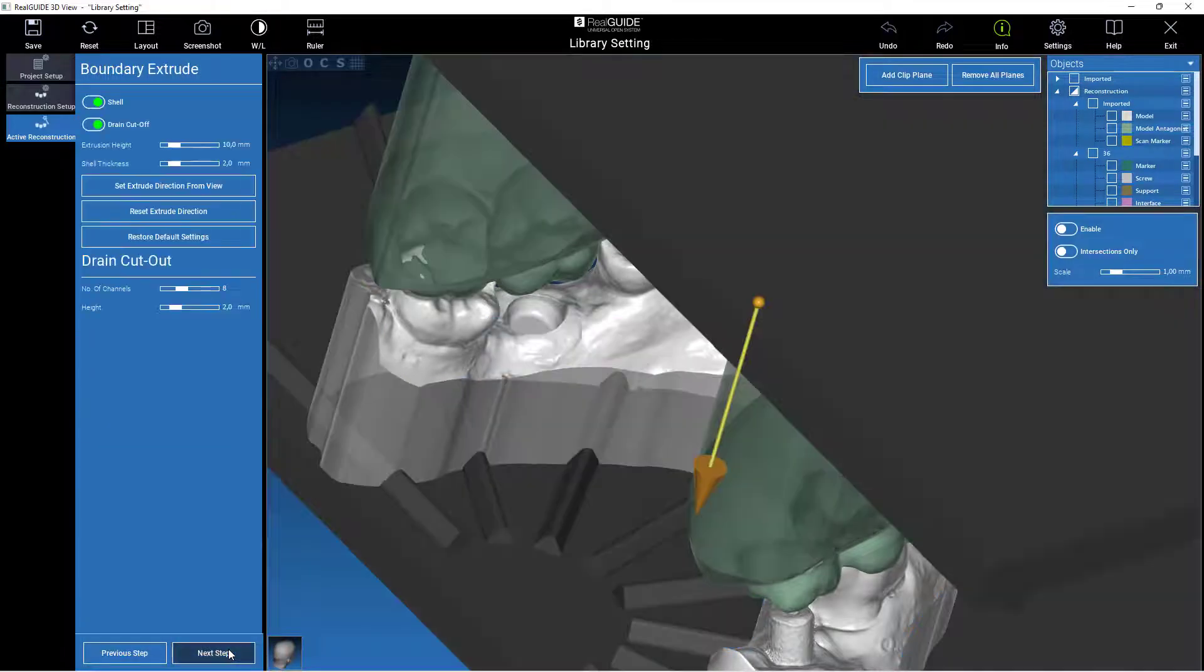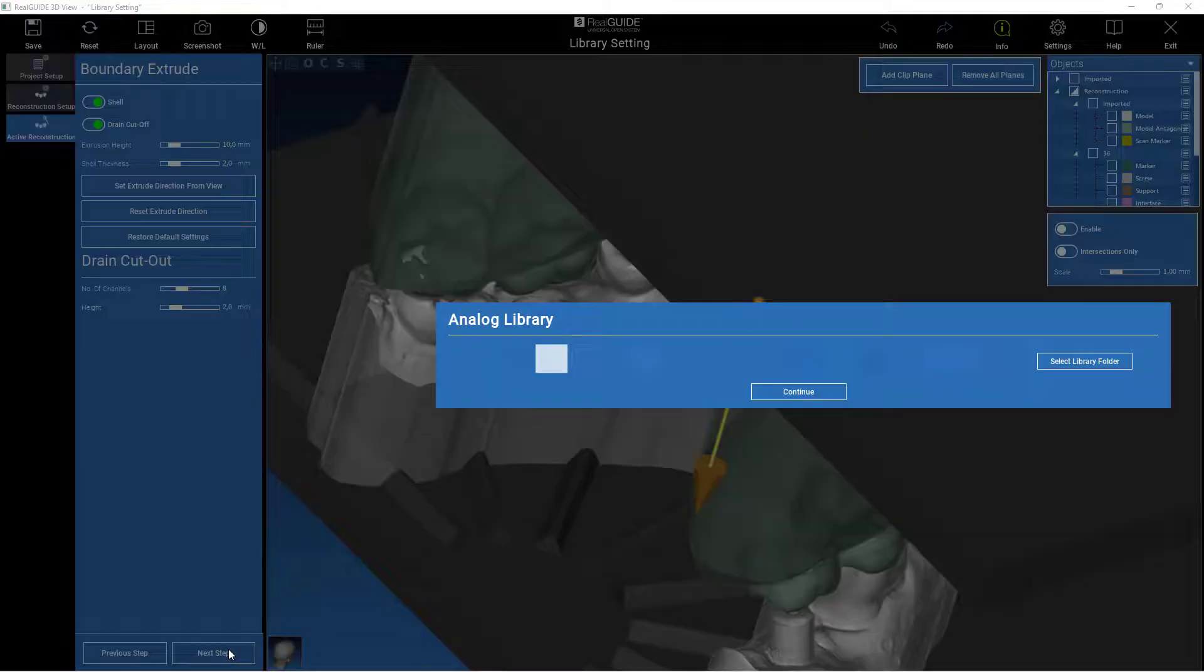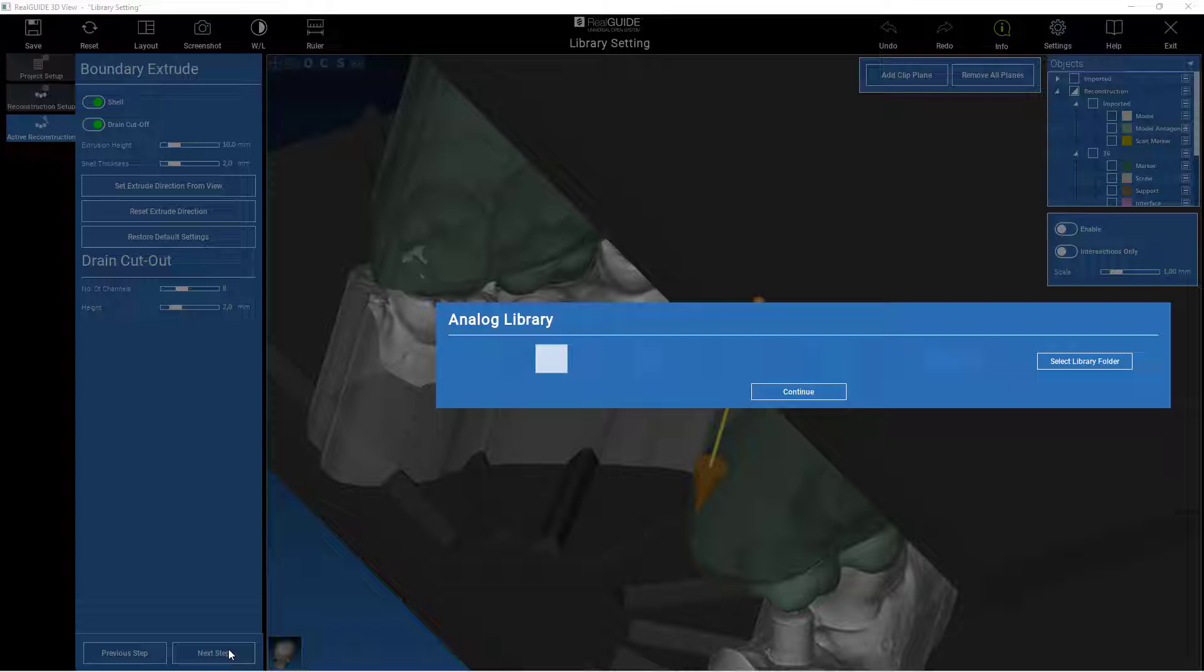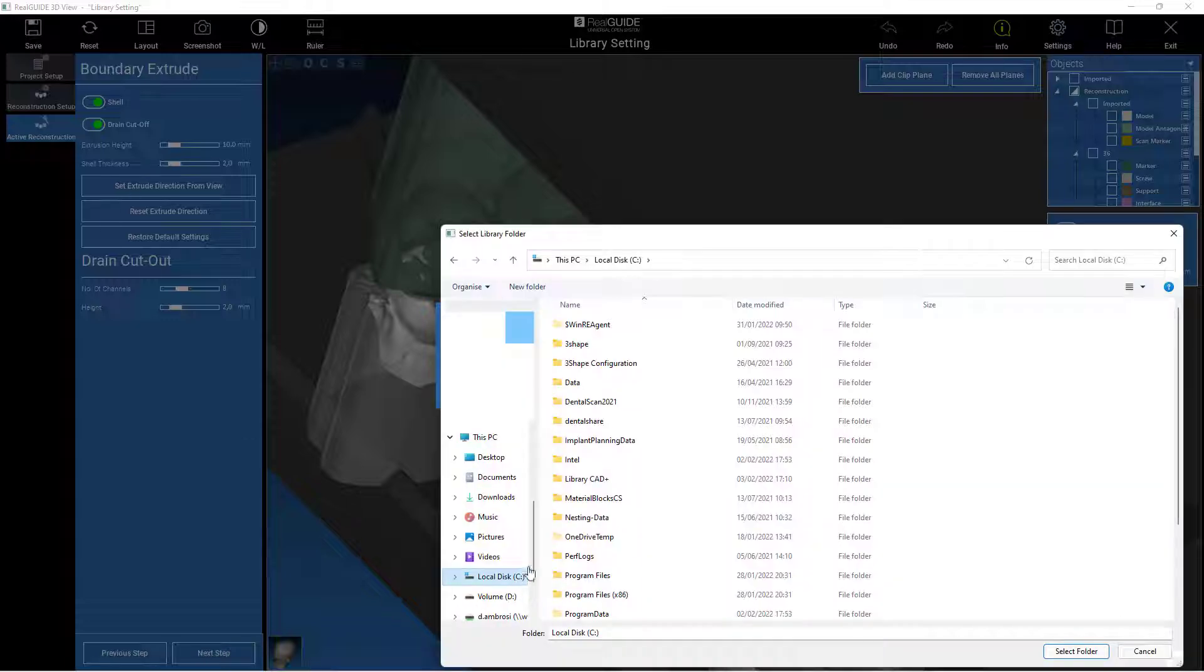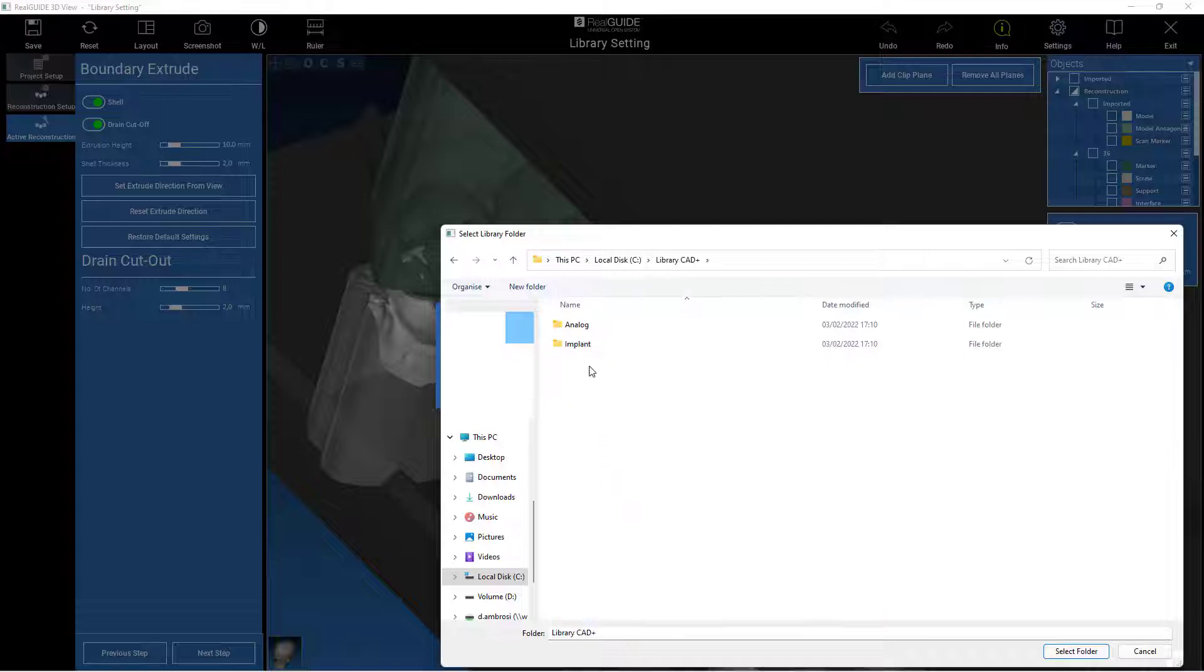For the analog libraries during the realization of the models, the analog folder previously created must be set as the path, and the analog recognition will be automatic.